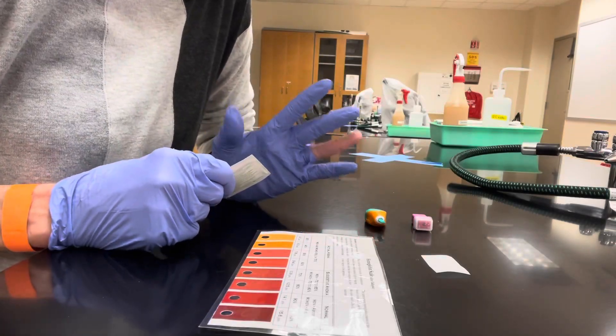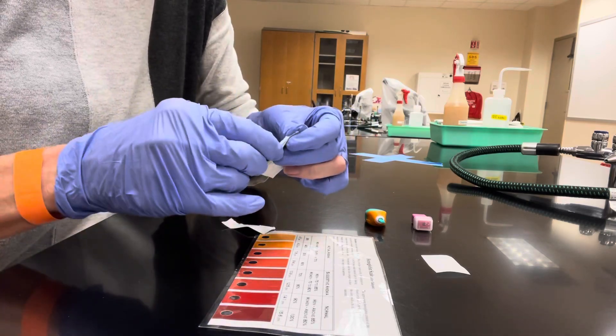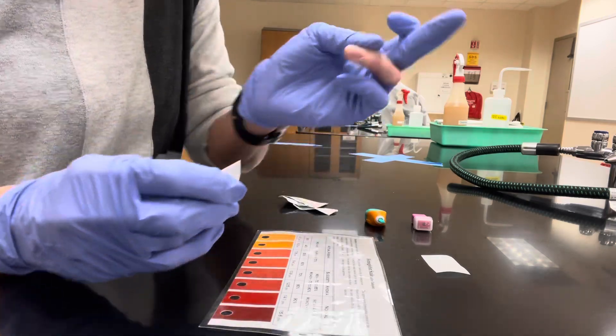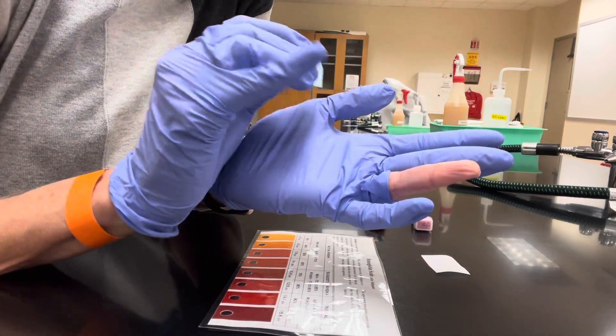Once you have your hand ready, take the alcohol towelette. You're going to clean the area that you're going to use the lancet on to get your drop of blood.